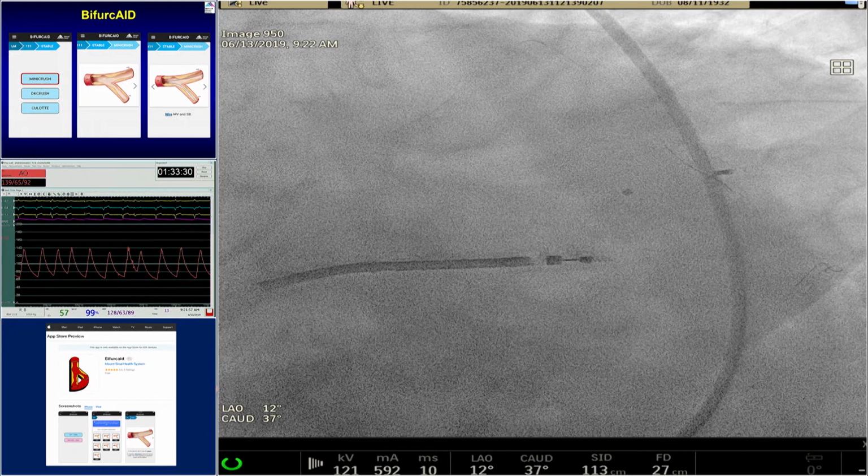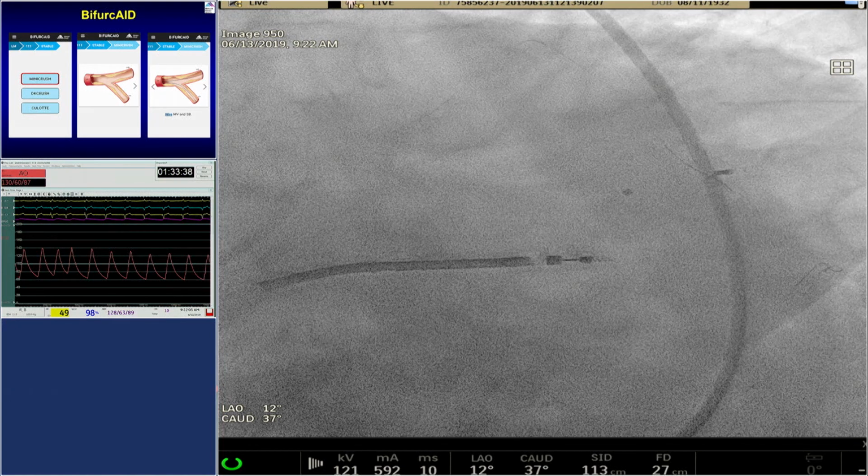I think Dr. Sharma has moved on to the next case. Yeah, so Roxana, let's give you the room 3 case now. Yeah, let's go to the next case. We'll come back to you. This has been an amazing, unbelievable case. So we'll go to Dr. Sharma, and hopefully you'll join him and then show us this final result, because we have 3 cases in the next half an hour. 2 more cases.